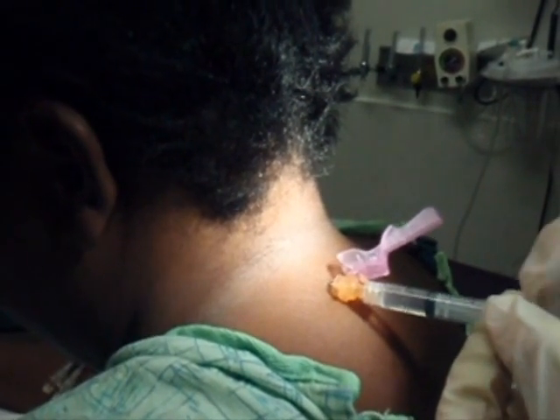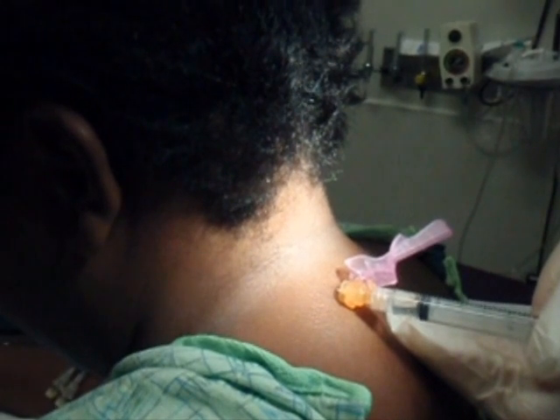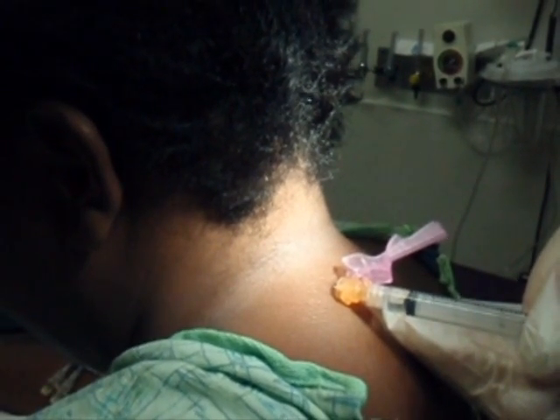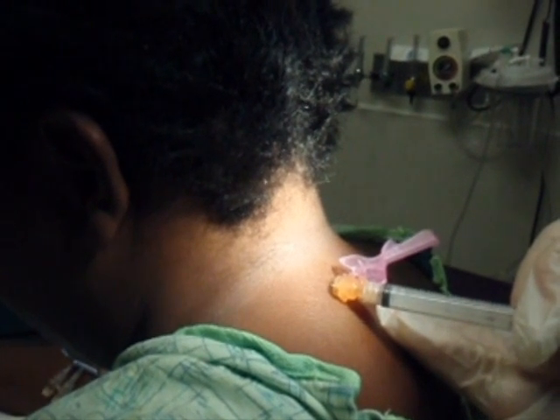I'm going to go ahead and spray the other side. Make sure I aspirate again. I'm going around C6 to C7, going parallel to the bed. And that's it.